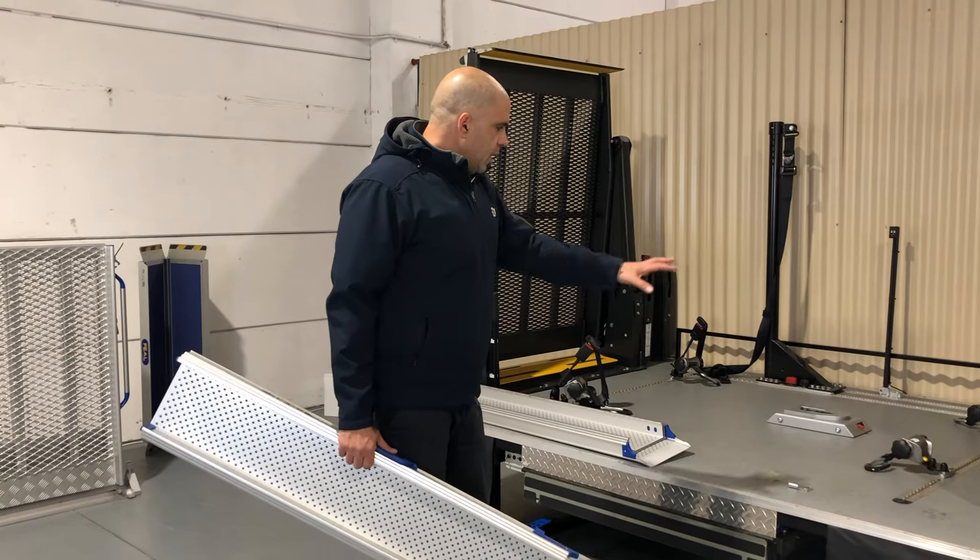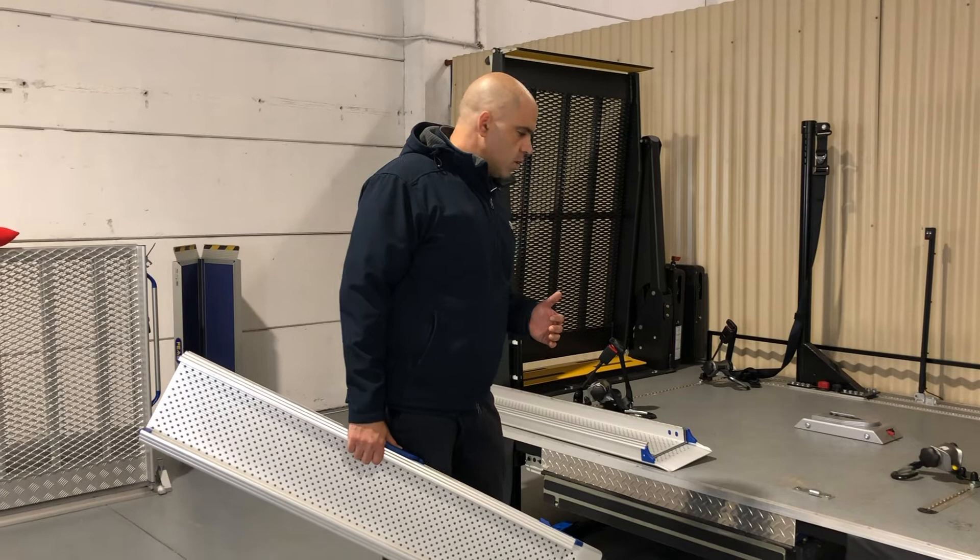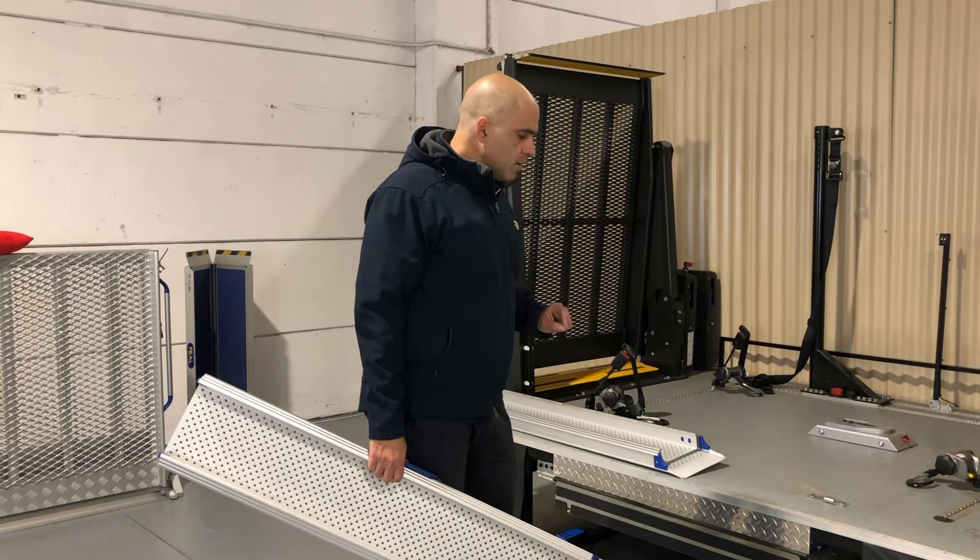What I have here is a training bench that we use here at our facility in Hornsby at Mobility Engineering. We want to use our imagination a little bit today and pretend that this would be the back of a van or a vehicle, and I can then show you how this thing would work.